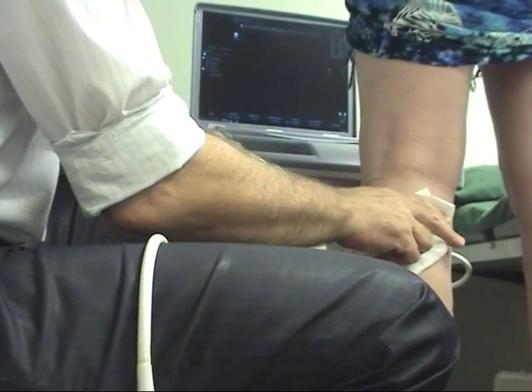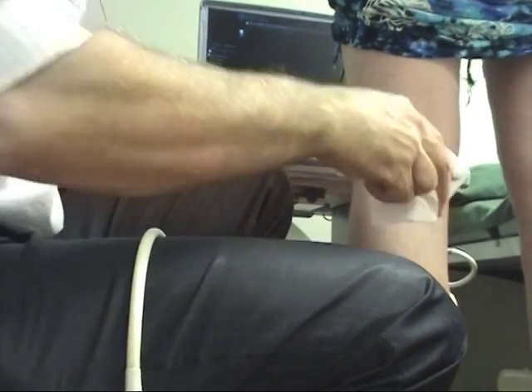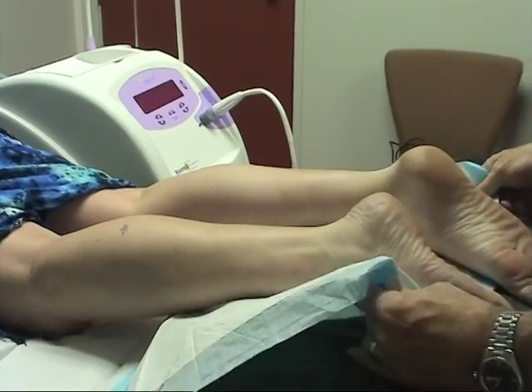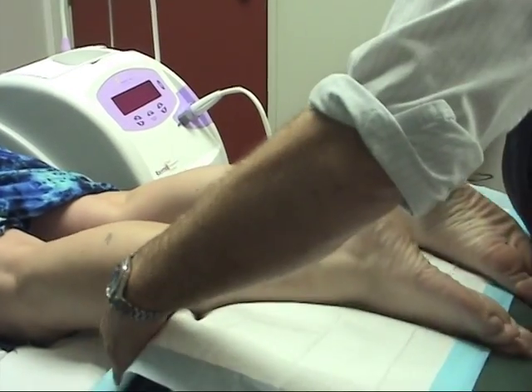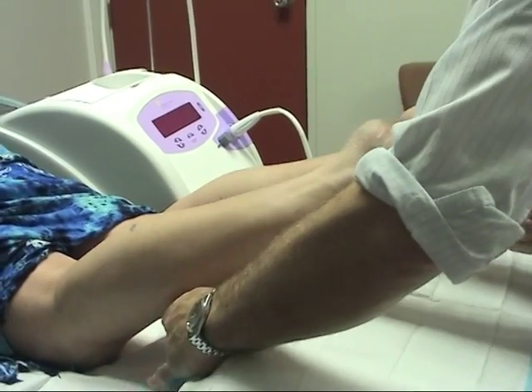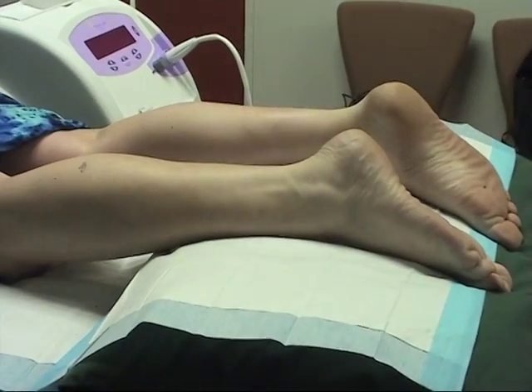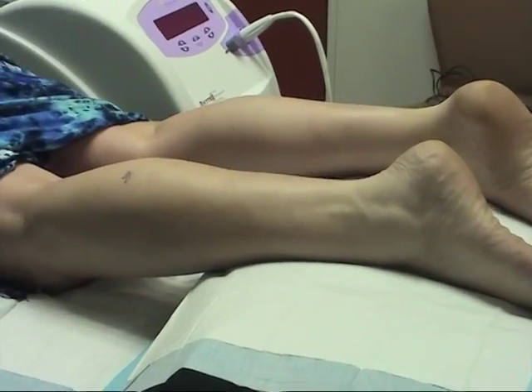You're going to be lying for about 40 minutes, as long as you're comfortable doing that. You can lie with your head down that end. And I'll just get a pillow to put under your feet so you can take the tension out of the back of the calf. I'm going to put a few drapes around under there as well.